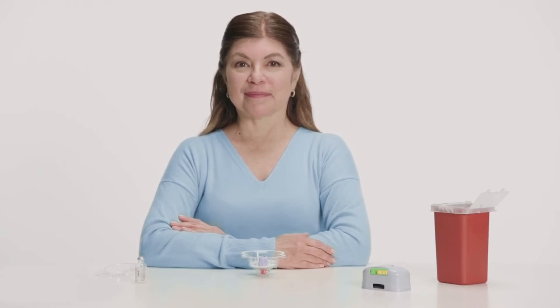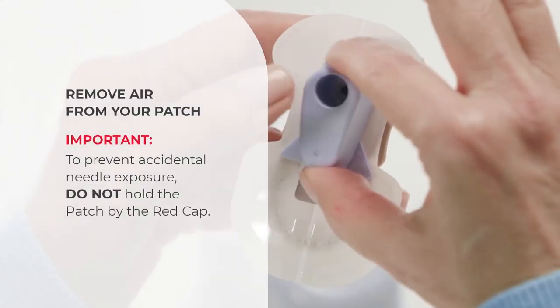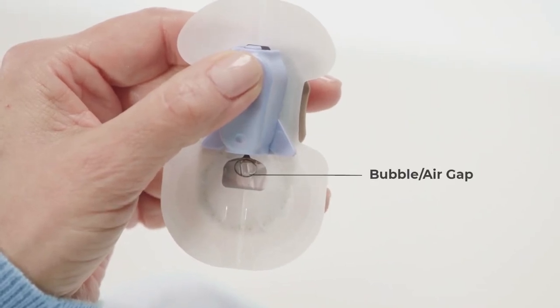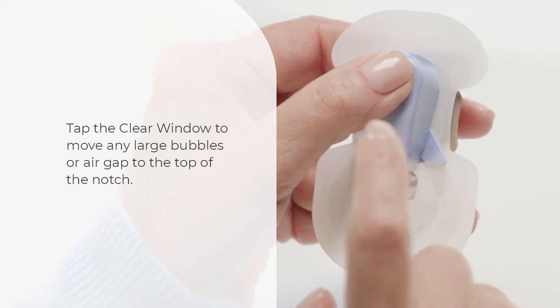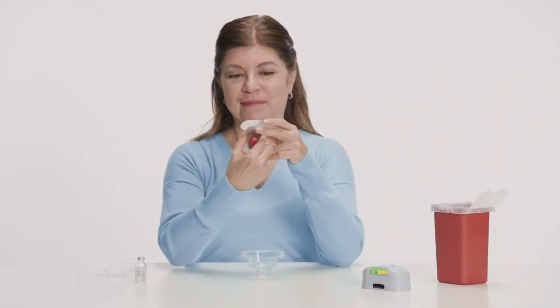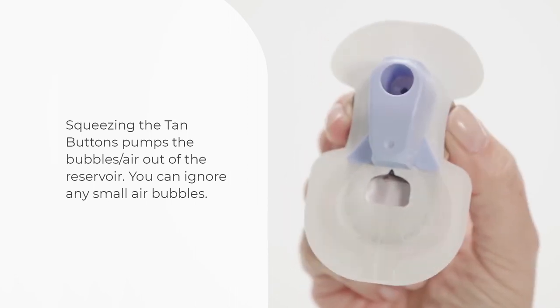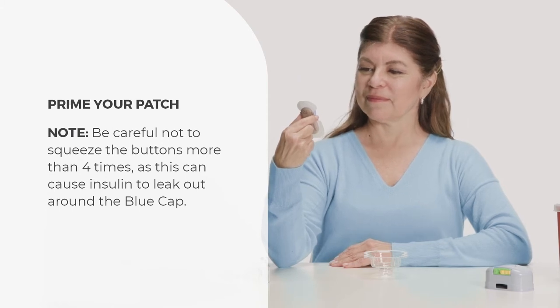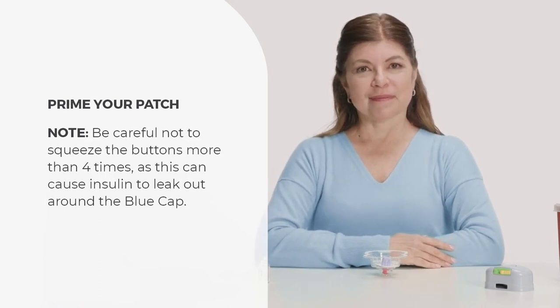Priming removes all the air and ensures that the patch's internal tubing is fully filled with insulin before you dose. Carefully remove the patch from the tray, picking it up by the blue cap. To prevent accidental needle exposure, do not hold the patch by the red cap. Hold the patch firmly in a vertical position with the blue cap facing you and the clear window below the blue cap. Tap the clear window to move any large bubbles or air gap to the top of the notch. With the bubbles or air gap at the top of the notch, squeeze the tan buttons until any large bubbles or air gap disappear. You can ignore any small air bubbles. Once the air is removed, squeeze the tan buttons four more times to prime the tubing. Be careful not to squeeze the buttons more than four times, as this can cause insulin to leak out around the blue cap. This step ensures that the tubing is filled so insulin, not air, is delivered when you first dose the patch. The patch is now primed.